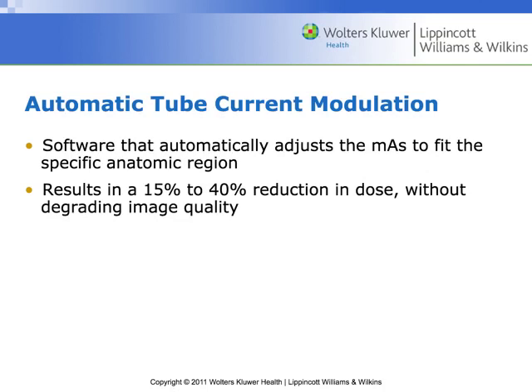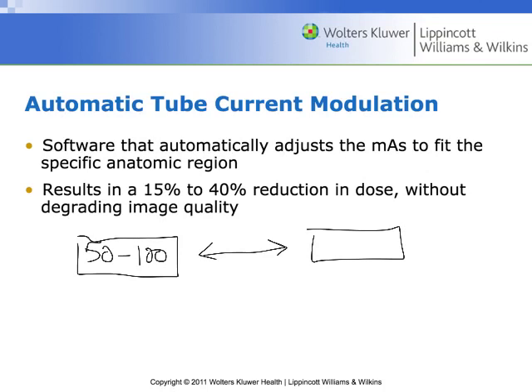What it would look like in the CT program is I'm setting up a protocol. I would have a little window here where I could define, I want my MA range to be from 50 to like 100, right, as I'm scanning. And then I'm going to tie that to some acceptable amount of noise. So typically this is expressed in a percentage, right? So let's say I want to maintain a noise level at or below 30%, right? So the machine is going to try to maintain a noise level at or below 30%, and it's going to work through those range of energies to determine that, right?